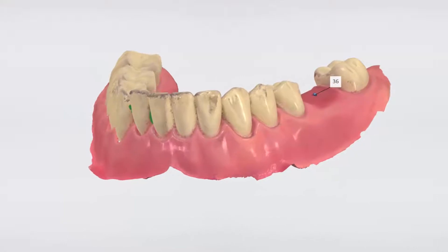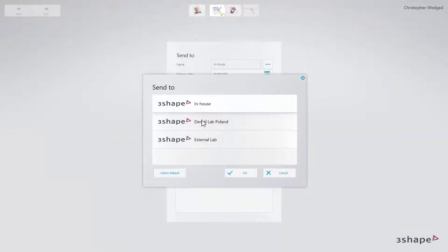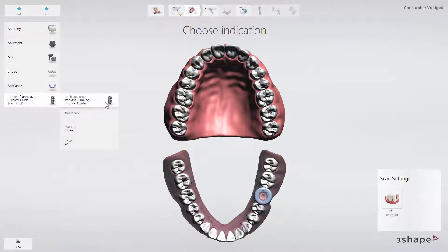tooth-supported surgical guide. After adding your patient, start a new case and select the laboratory of your choice. This laboratory will manufacture the guide later. Set up the order form for implant planning. Start by marking the desired region — here we mark tooth number 36 — and open the implant planning tab. You should also mark implant planning and surgical guide in the corresponding menus.